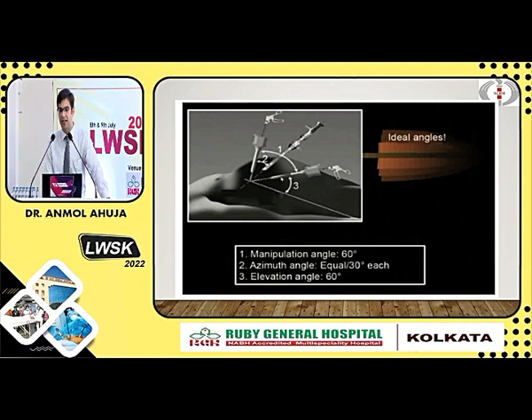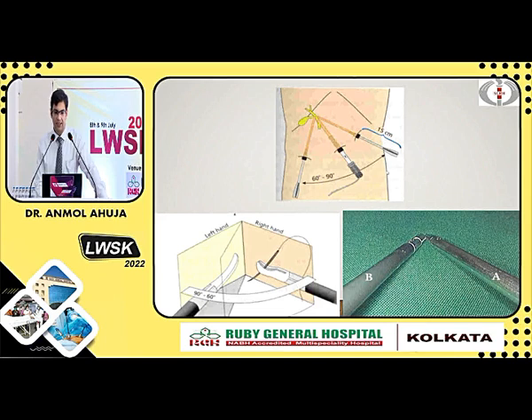Azimuth angle ideally should be equal. So this is the scope, and the second number is the azimuth angle, which is 30 degrees on each side. And the elevation angle is the angle between your patient and the instrument. If this is lower down, again it will cause a lot of trouble on your shoulders and the arms. So again the similar diagram, I hope it's clear now.